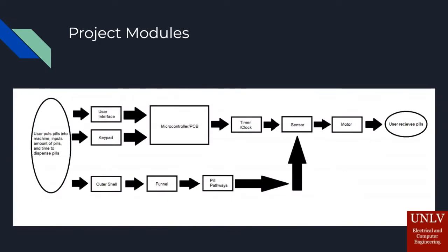Basically, it explains how the flow of the whole system works. So the user puts in the pills, inputs it, and puts in the time. That goes into the user interface through a touch screen, and then that is controlled by a microcontroller. And from there, the microcontroller will save the time, and then once the time is sent, the outer shell, which is the containers, the pills will go through the funnel, through the pathways, touch the sensor, and then that pill will be counted, and then the motor will move out of the way for the pill to be dispensed.